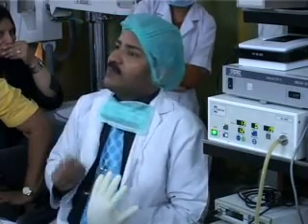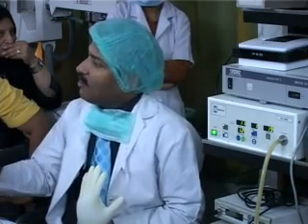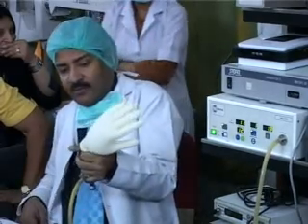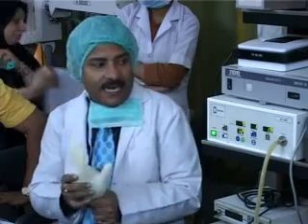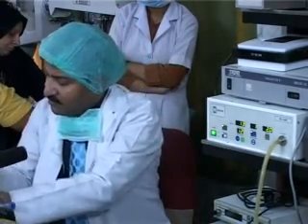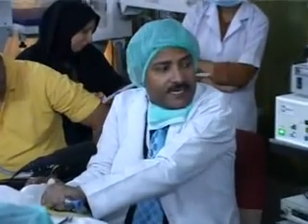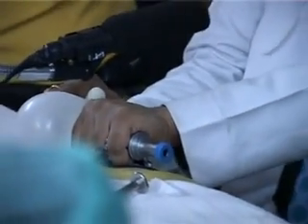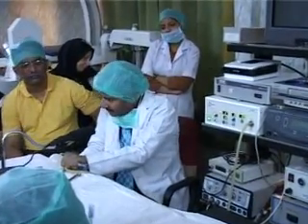So the main purpose of the insufflator is to keep the actual pressure at the level of preset pressure. If I leak somewhere, it will again start flow and it is again coming to 12. Not only that, if I press it from somewhere, like I am pressing it this way, then you will see it will withdraw the gas back. It is giving an alarm, and after the alarm it will take the gas back. Now it is taking the gas back.